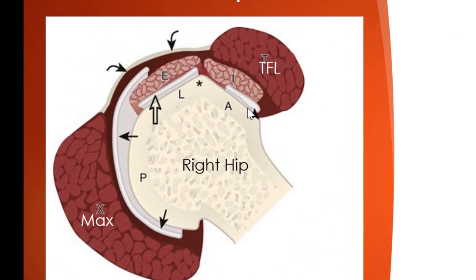And that bump is the transition between the anterior facet, where our minimus inserts, and the lateral facet, where our medius inserts. So if we were to look at the tensor fasciae latae muscle, then deep to that, keeping the muscle up off the bone, is the gluteus minimus. And then we see our iliotibial tract connecting TFL, superficial layer, back to gluteus maximus. And then under that, obviously there's a bursa.